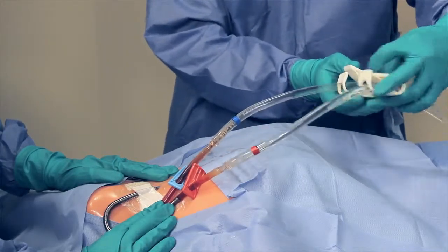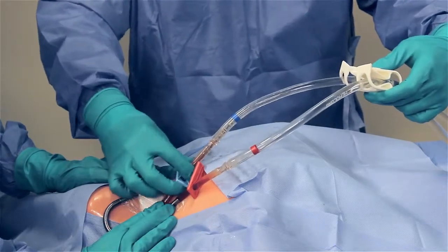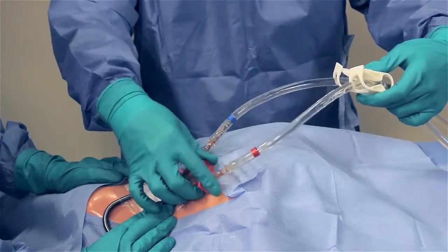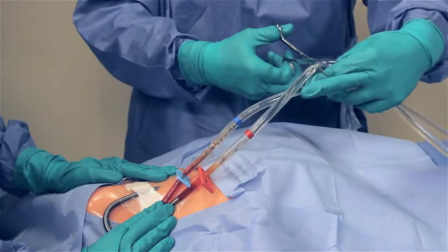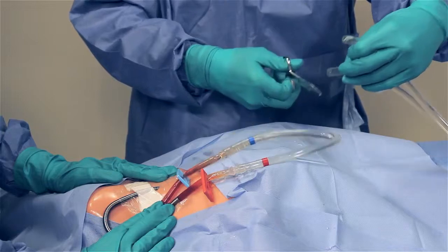Close all four clamps. Cut the blue and red tubing between the tubing clamp and the catheter barb in the area that was previously cleaned.